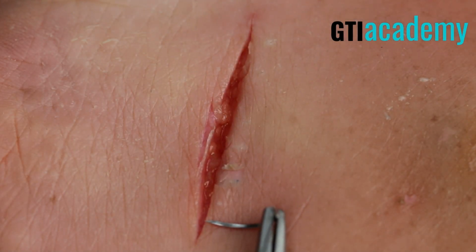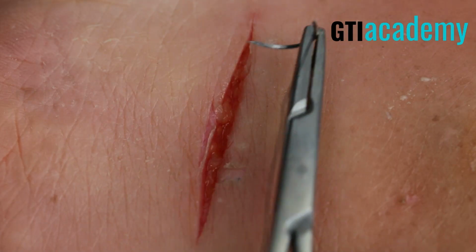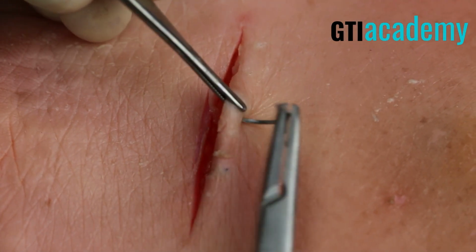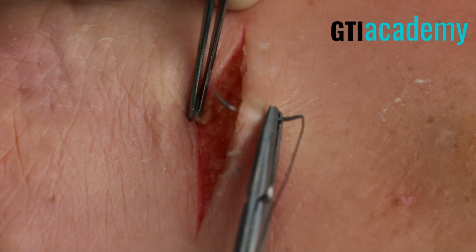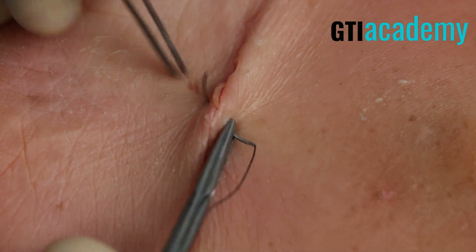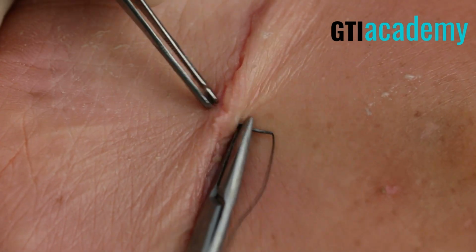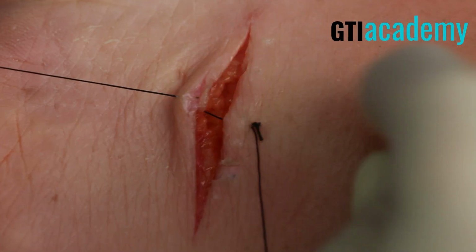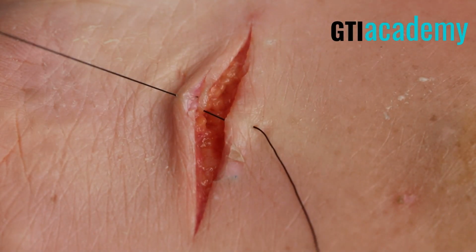For this simple interrupted suture, the first thing I like to do is to throw a suture in the very middle of the wound. So look at the end, and let's put one right in the middle. This will help approximate the wound, but also keep equal distance in between each suture. So as you drive the needle through, complete the circle. Drive the tip, there you go, to the right.